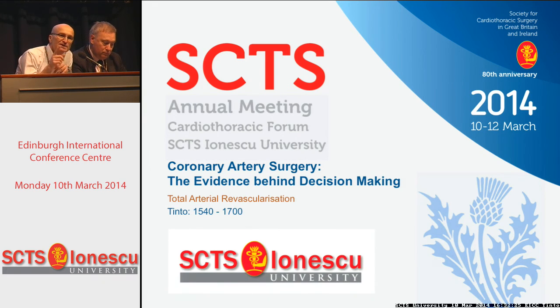Now, when you start measuring or assessing your grafts, one of the things that you quickly learn is that most grafts which are blocked, there's no change in the ECG, there is no change in the blood pressure, and you're unaware of it. And you become aware of this very quickly when you start routinely assessing grafts. So my philosophy is, do you have a duty, almost an ethical duty, to make sure, if nothing else, that your patient is leaving the OR with a patent IMA? Or in my case, I would say with 2 patent IMAs.